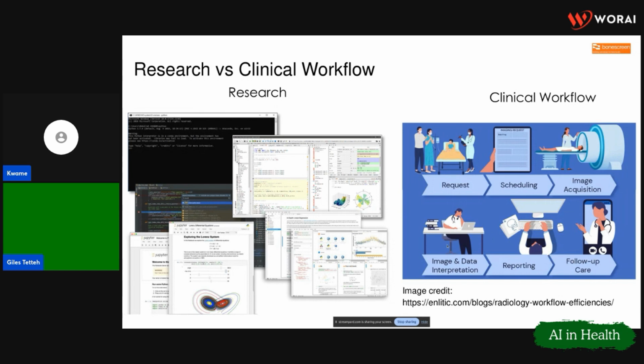This schedule is so tight that if you are bringing anything into this, it has to improve their work. And one way to do this is to fit in between the image acquisition and the image interpretation, right? This is where we want to fit our model. And we have to do it either by automatically doing the interpretation or enhancing the process.